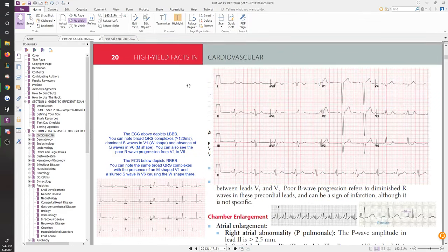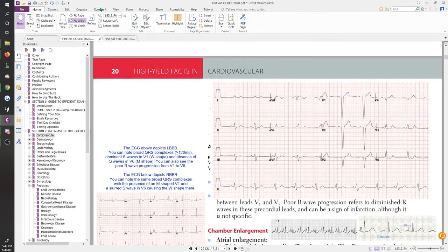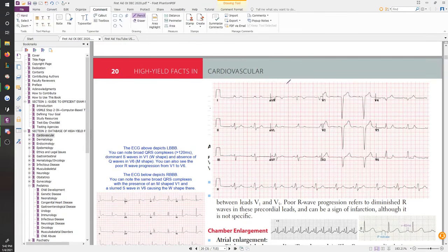So let's evaluate this ECG using everything we've talked about so far to make sure we see what we're supposed to look for. So as usual, you're going to cut it down half. In the middle, you're going to look for R wave progression, and right away, before you can even start looking for R wave progression, you can already see there's a problem.